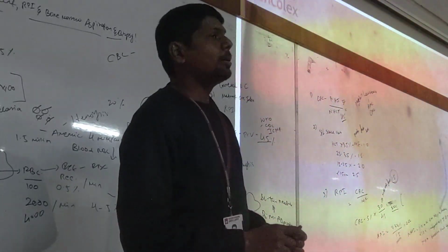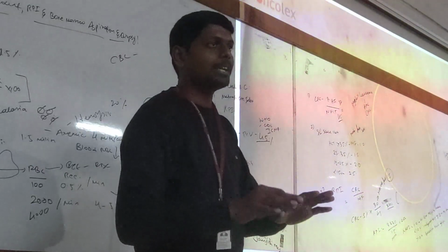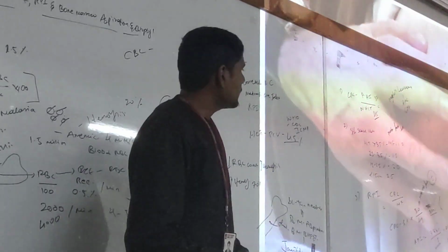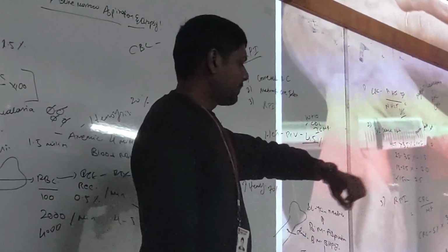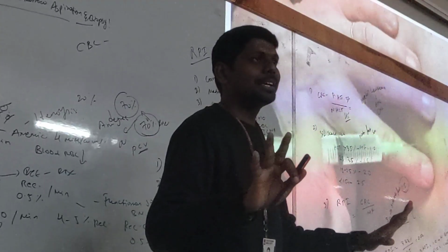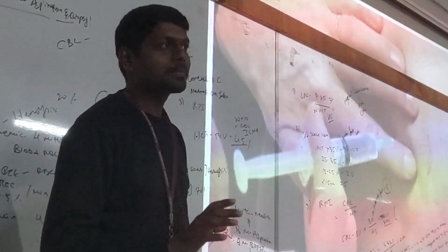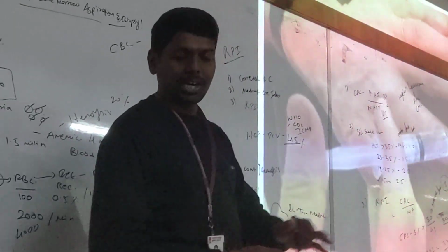This test will be performed by a physician actually, doctors guided by nursing and lab technicians. Now we need the sample, so we will guide them. First, clean the area, give anesthesia. Listen, this anesthesia won't work at all in reality. For name's sake, we are giving anesthesia for reducing slight pain, that's it. So we are giving anesthesia at the site of this one.